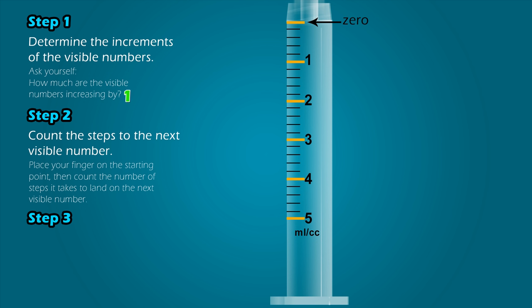Step 2: Count the steps to the next visible number. Notice that you have long lines, which have the visible numbers next to them, and short lines, which do not. To determine the values of those shorter lines, we count how many lines it takes to get from one visible number to the next. Using the line of the first visible number, 1, as your starting point, count how many steps it takes to land on the next visible number: 1, 2, 3, 4, and 5. It takes 5 steps. Note that we did not include the starting point — we only counted the lines after it.